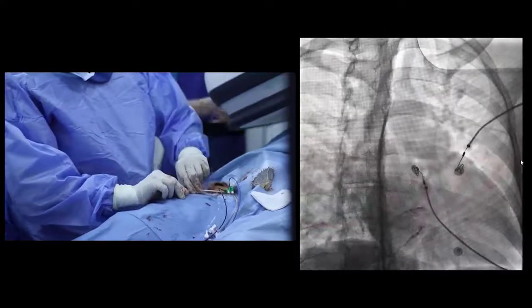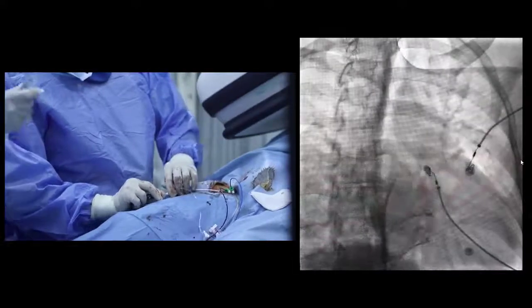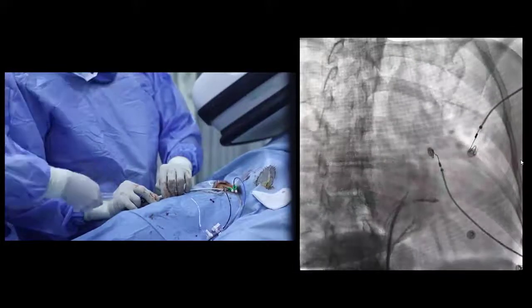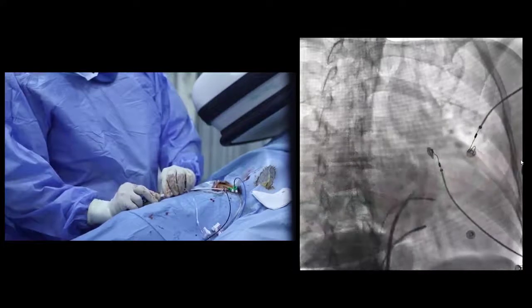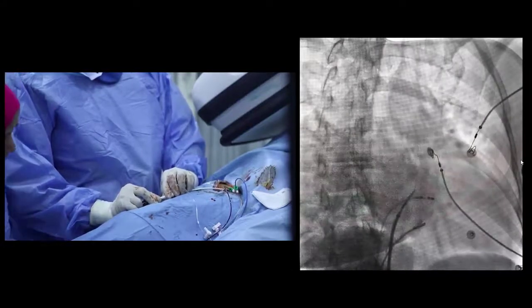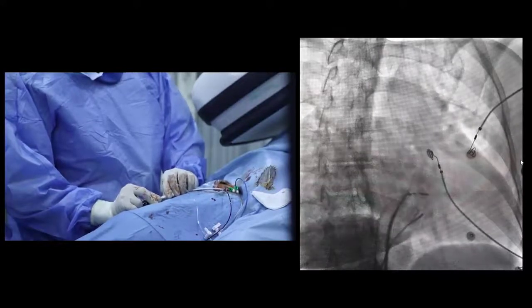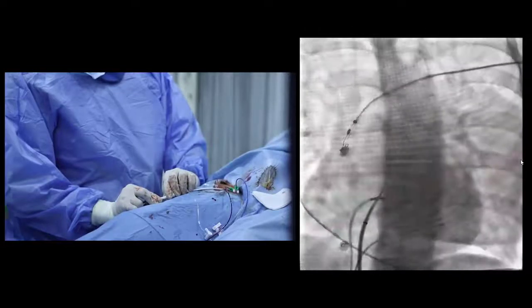Now we can see a little bit the quadripolar catheter marking the His region and the root of the aorta, and we are now adjusting to a more posterior position of the transseptal needle.